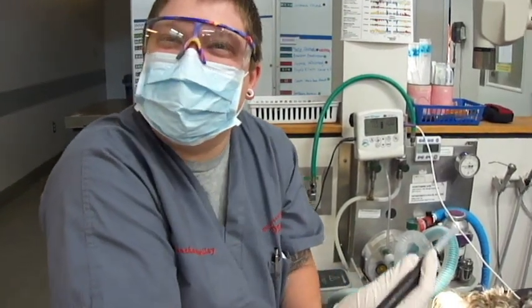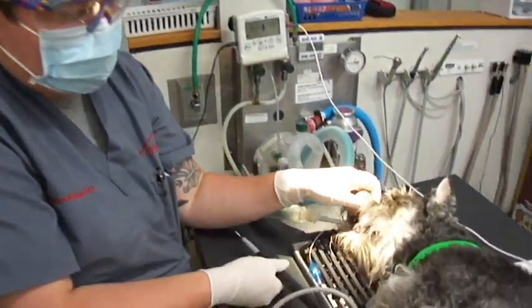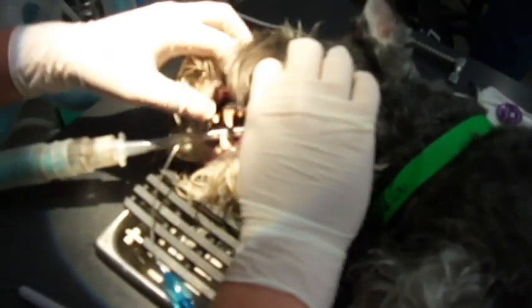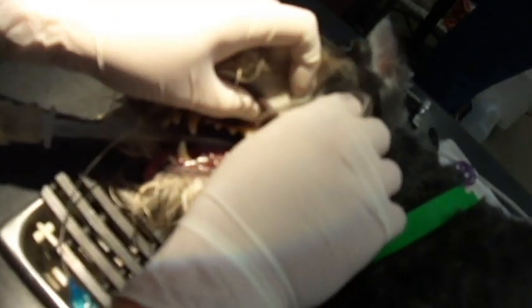Hi, I'm Samantha Swilley here at VCA Animal Hospital. Today we're doing a dental on this Schnauzer. We're going to start by doing the oral exam to just kind of see what's going on in here. As you can see, we have some plaque here and here, and we're going to get that off today.